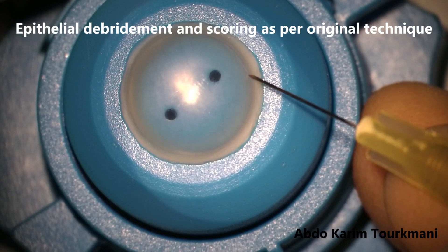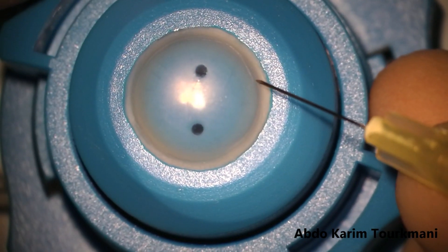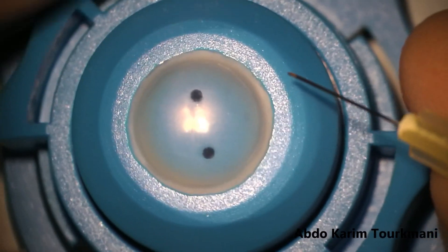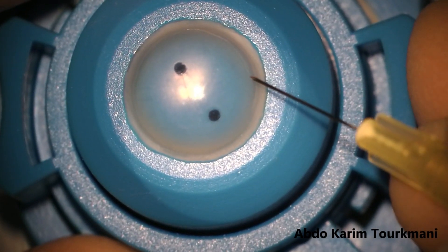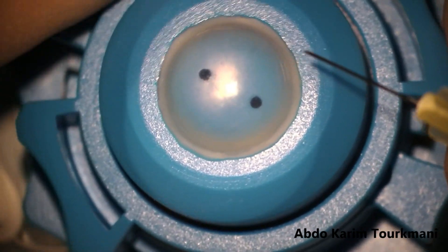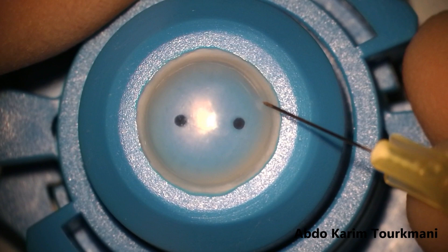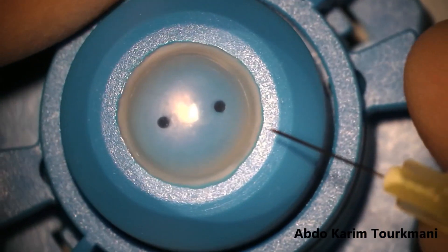This is basically quite similar to the original technique, but I think that these few modifications helped me to be more successful on getting a nice graft. I'm not trying to say that this way is better or worse or equal to the original technique, but simply that this works best for me.